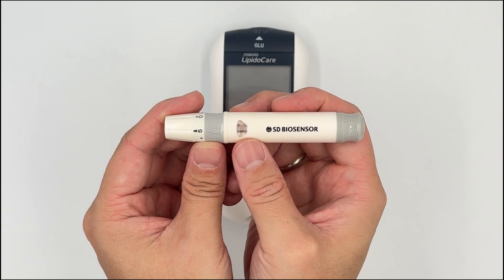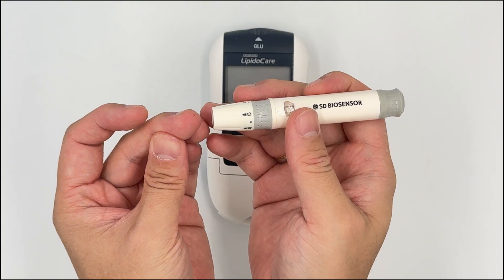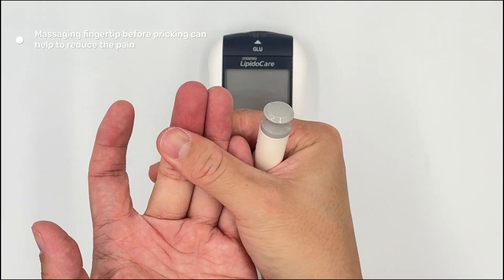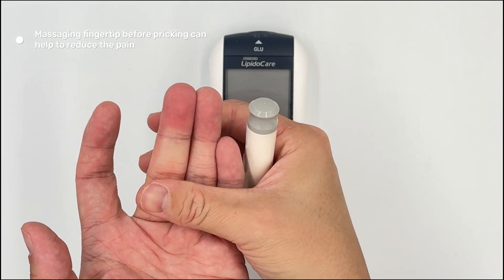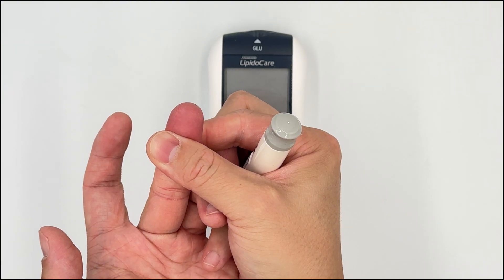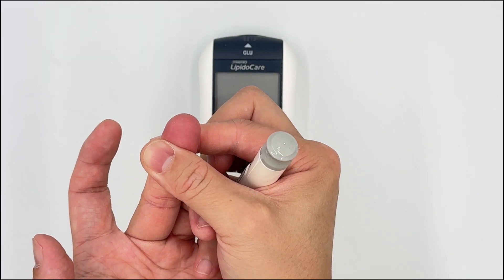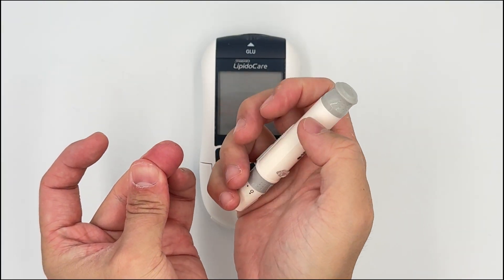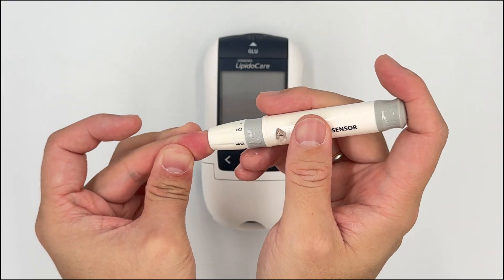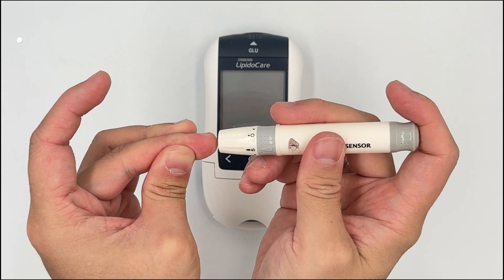Tip number two is to reduce pain for your patient when you prick them. First, massage the finger before pricking, then hold the finger firmly for five seconds — you'll feel that the area becomes a little bit numb already. Continue the pressure and place the lancing device firmly on the skin. You want to press it firmly so it doesn't shake.